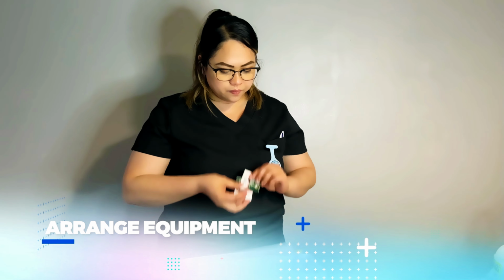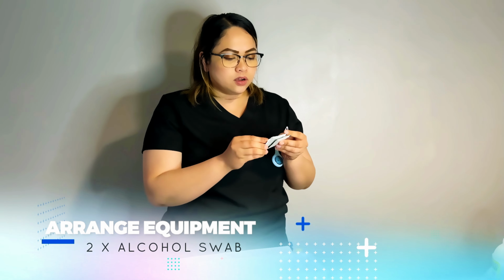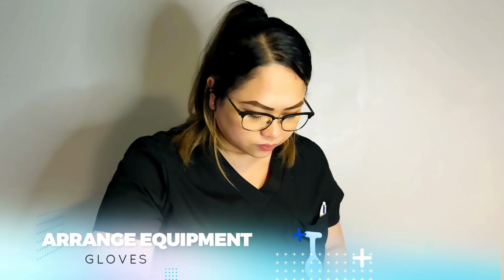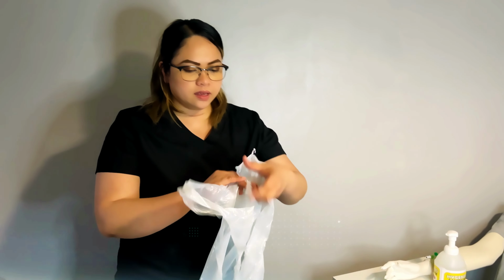The next one is the alcohol swab. So I'm gonna get 2. So I got here the Clinell wipes, Clinell swab, chlorhexidine, 70% alcohol, clean and intact. Expiration date is 9th of 2023. I'll get 2. My gloves. And the prescription itself. I'm just gonna wear my apron.